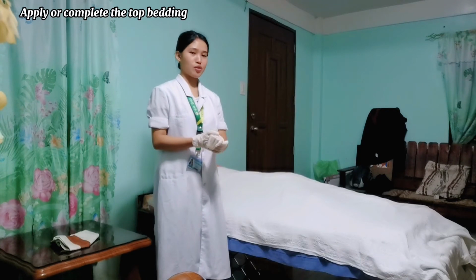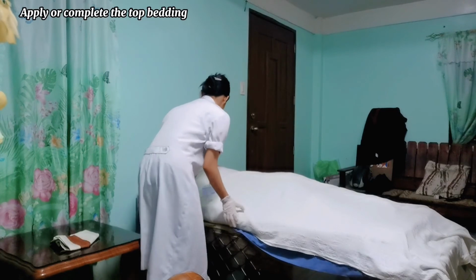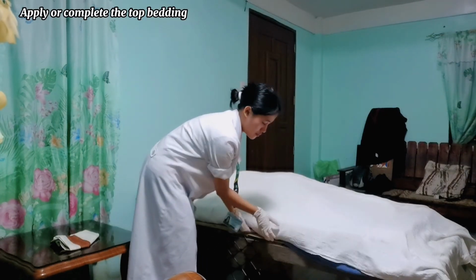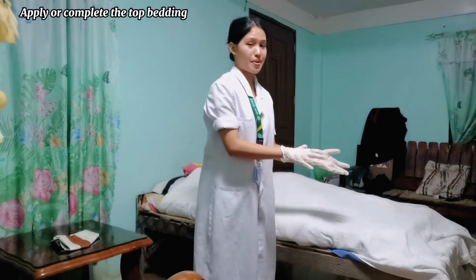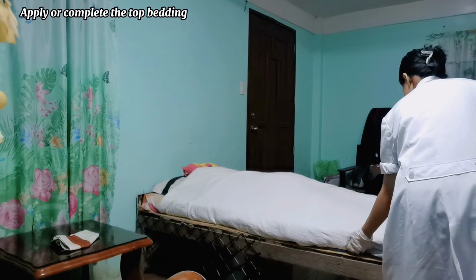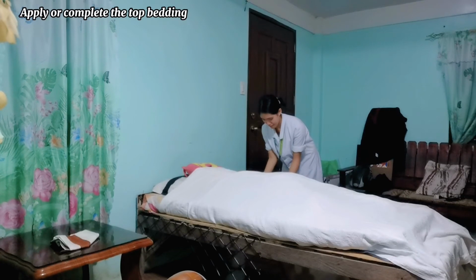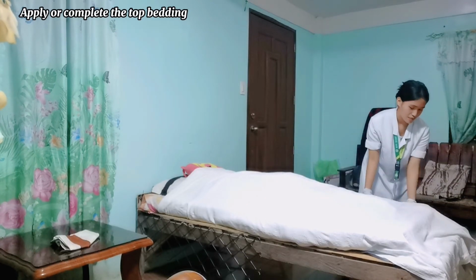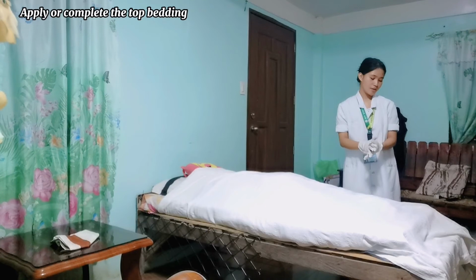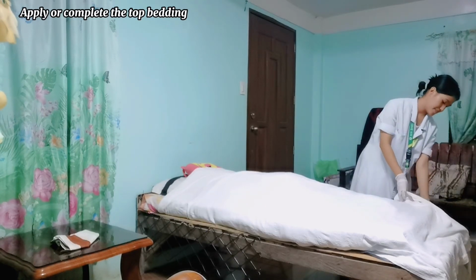And after that, we are going to tuck it in under the mattress. Also, make sure to tuck the bottom under the mattress. And then miter the edges at the bottom of the bed.